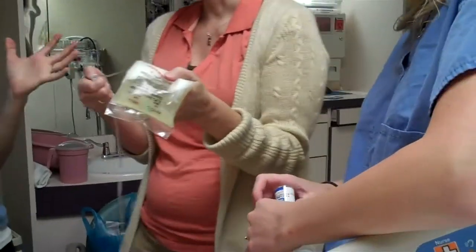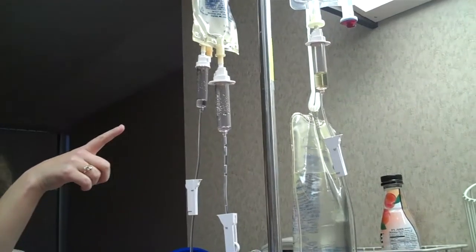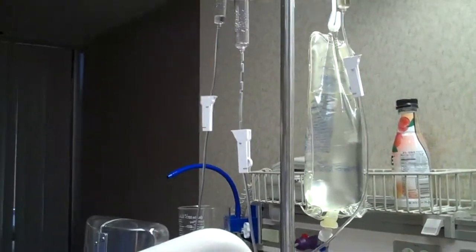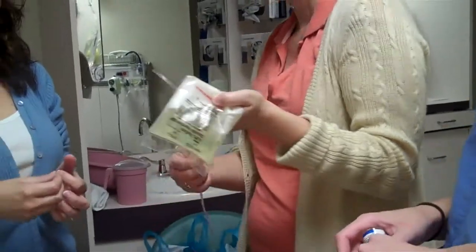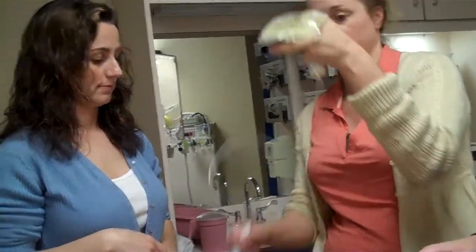So when you open the clamp, like you can see, this clamp is fully open. See how it's dripping? Which is going pretty slow, but it's on a pump. The pump is controlling it. If you roll this closed, you slow down the drip rate. So this is fully open, very fast drip rate, like water. As you go midway, very slow drip rate. So this will run on a very slow drip rate. Dapto, you can be clear up here. Doesn't matter. So your tubing will look like this.